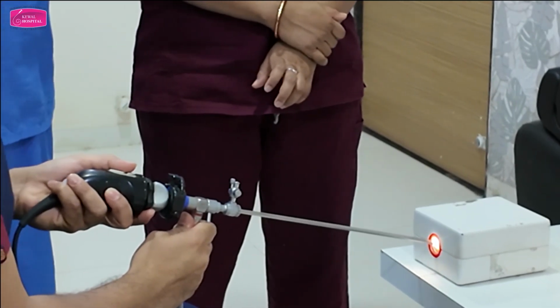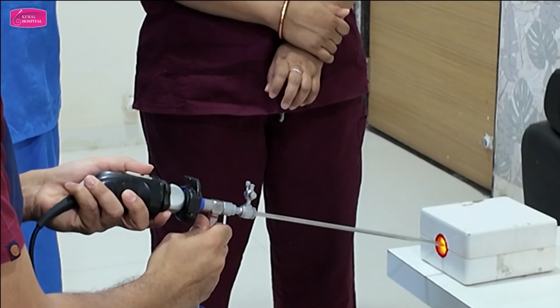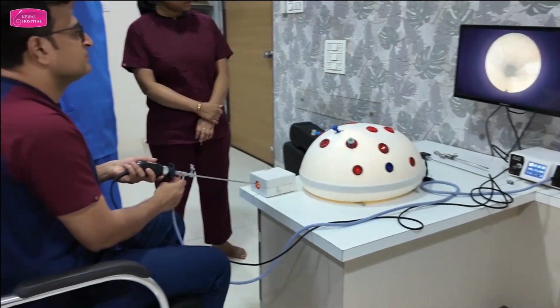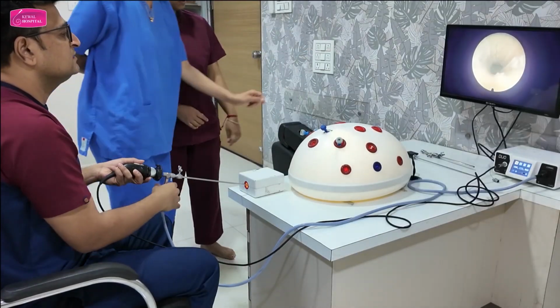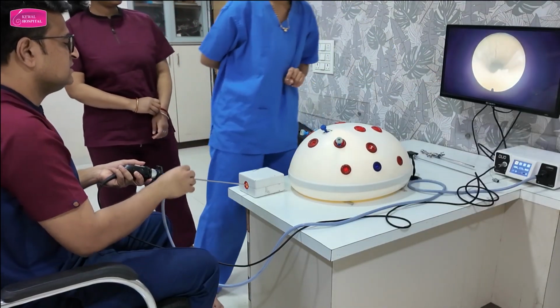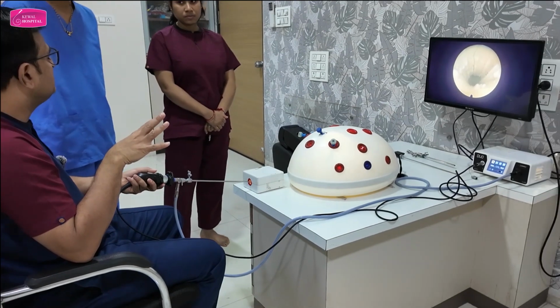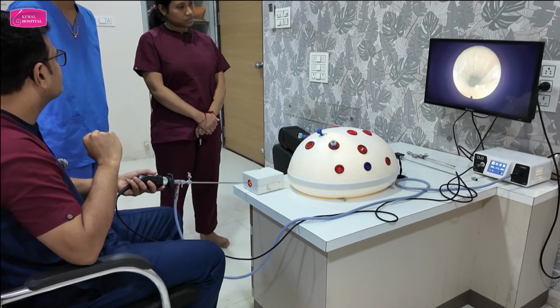Now you will go into the cervical os. Can you see the cervical os there? Yes. Now can you see the notch? Please show me the notch on the screen. Yes, that is the notch. Now the whole game of hysteroscopy is around that notch.